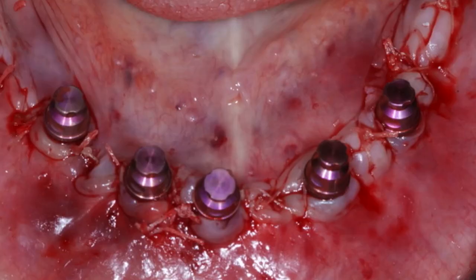So as we're looking from the occlusal view now, I can already see from the picture that the center one has got to be a little more uprighted towards the lingual. The back one has got to come a little more facial. And, you know, you have your system. But that's acceptable. That'll work now. You can really fine-tune it. It's just a matter of taking it with a little instrument and moving it. I mean, you can take your finger and just push it back.